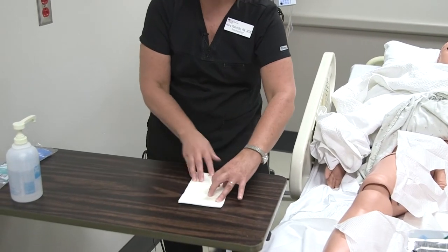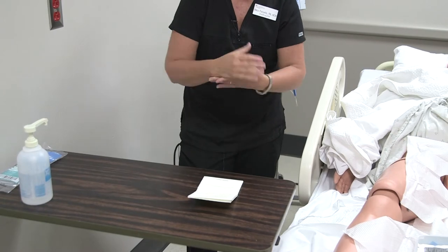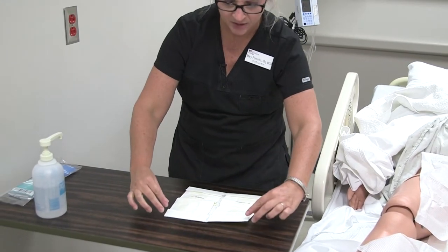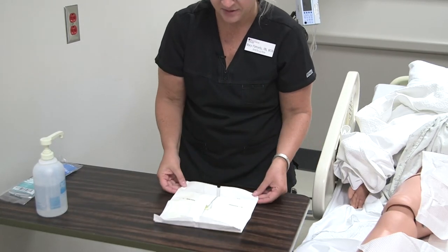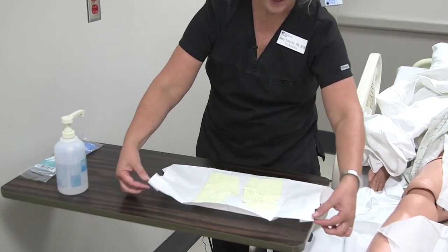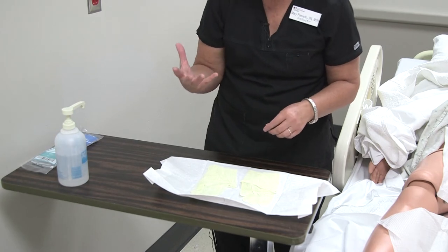Now I can go ahead and put on my sterile gloves. So always hand hygiene before you put gloves on and after you remove them. Okay, so again, you open these up, it tells you right where the thumbs are, and you're going to want to open the outer flap first, just like we did with the sterile package. We're going to do this again like this, and it sort of looks like a lapel. You're going to pull it out and give it a little tighten there, and you're going to put on your dominant hand first. Okay, so my dominant hand is my right hand.